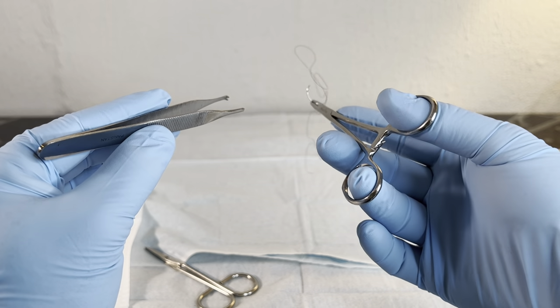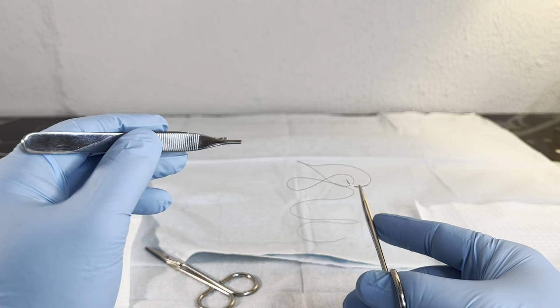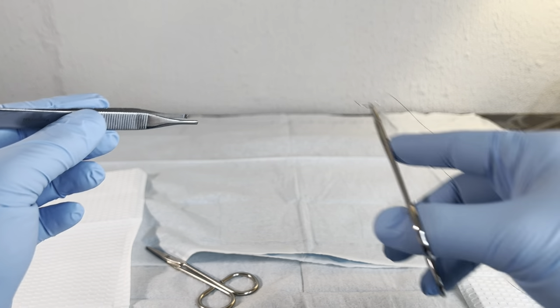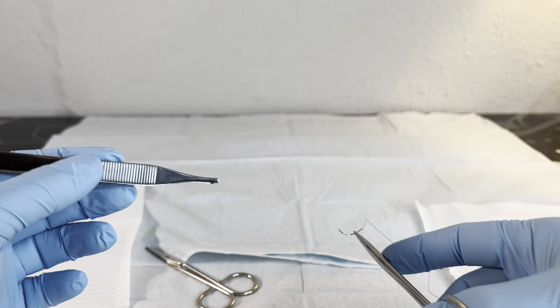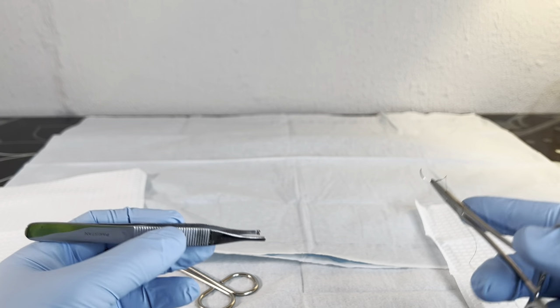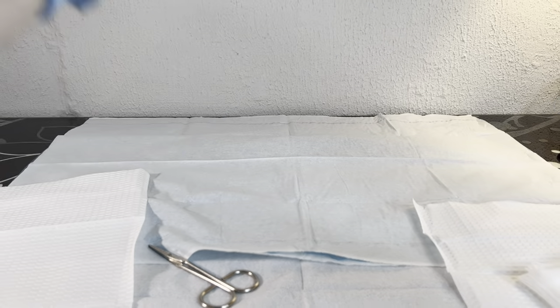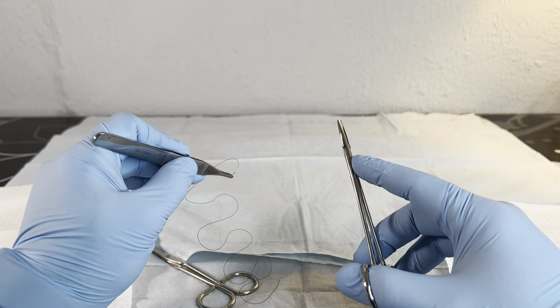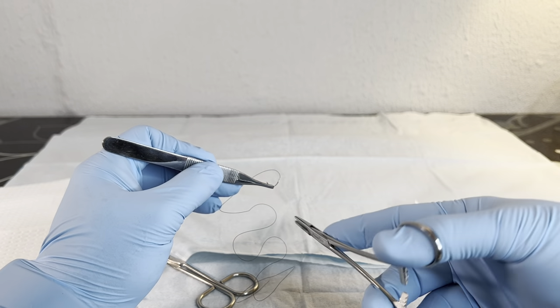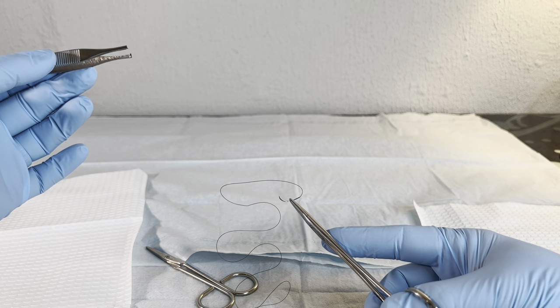The next thing I want us to focus on is an important skill that, if you don't think about this beforehand, it's going to catch you off guard when you're actually closing a wound. And that's going to be the manipulation and transfer from pickup to needle driver and then back into the needle driver. There may be times where you're about to start a suture and you realize that the angle is not quite right or the grasp is not quite right. So you're going to want to be comfortable with grabbing from your pickup and repositioning. A lot of times having your hand or arm resting on the surface to kind of stabilize things.